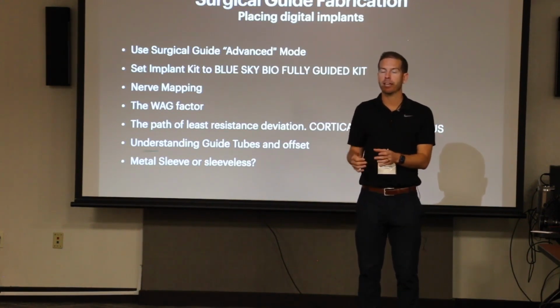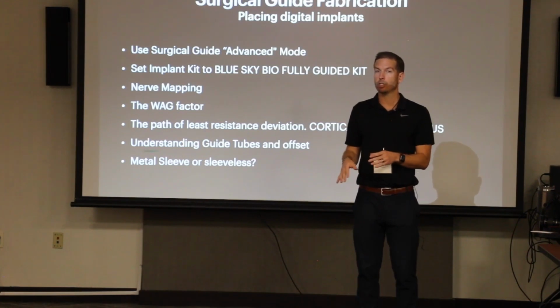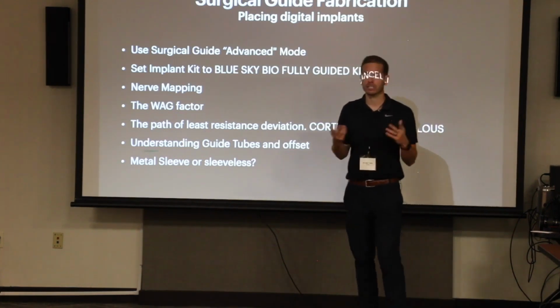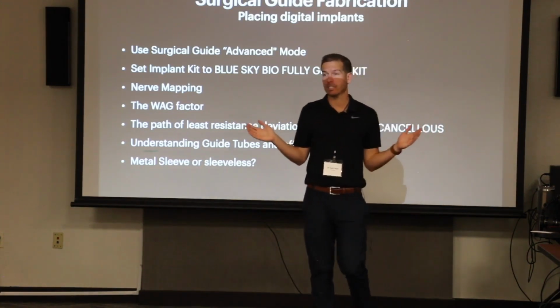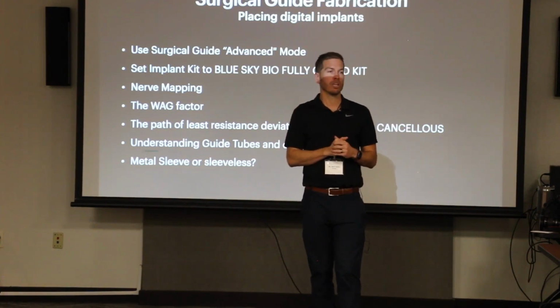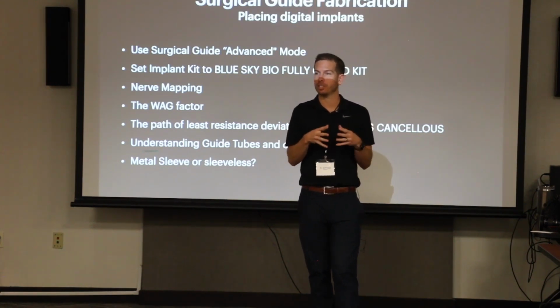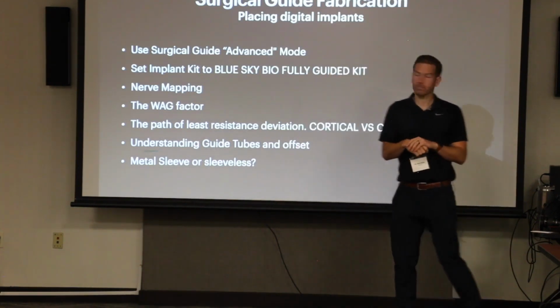You build this setting that I like with my printer, my hand skills, my preferences. So don't be afraid to print a couple. It's not $20 per guide. You pay $20 per export for as many guides as you want, unlimited guides on that patient, on that case. So don't be afraid to print a couple with 1/10 of a millimeter in diameter difference if you want to fine tune how tight you like that drill to be.